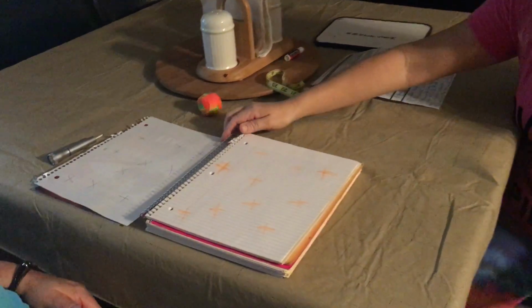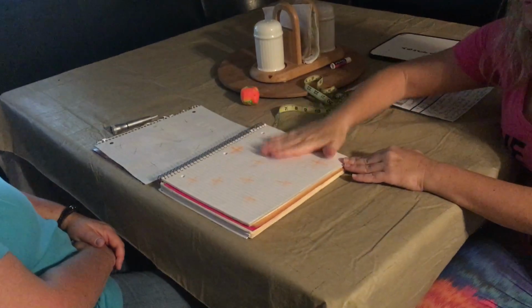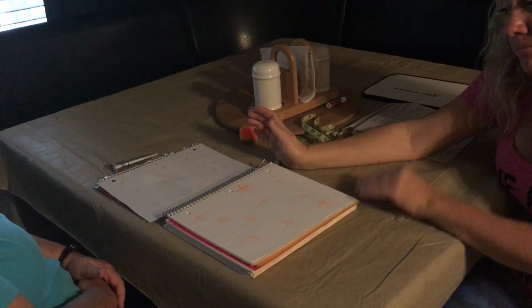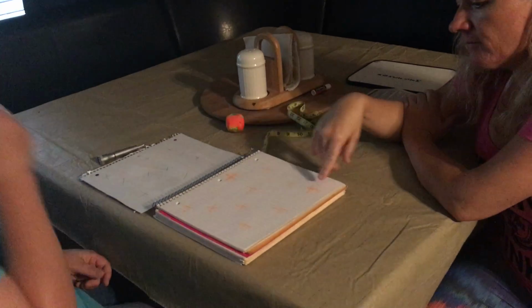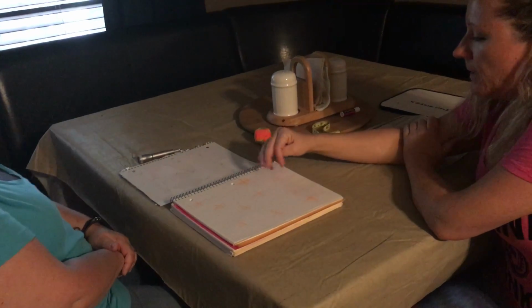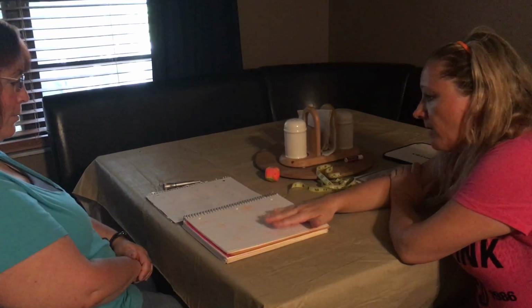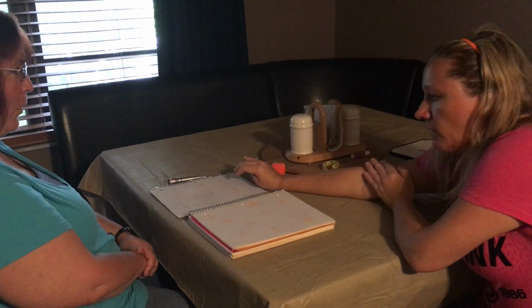Okay, thank you. So if I look and compare this to this, you did a pretty good job actually. Most of the plus signs I put, because I'm looking at the location where you put them, they're in a similar pattern. Some of the distances are different between my picture and yours, and also the angles. If you just look at it, I don't know if you can notice or not.